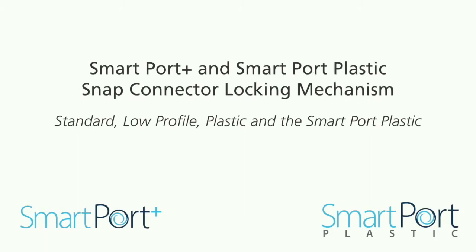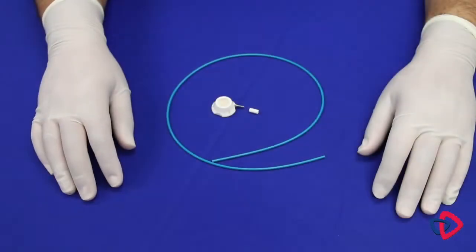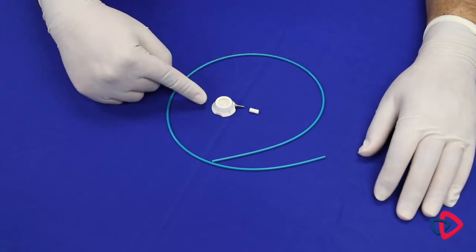In this section, we will cover how to securely connect the port stem and catheter of the SmartPort Plus standard, low profile, plastic, and the SmartPort plastic using the snap connector locking mechanism. You will find the catheter, the snap connector locking mechanism, and the port body are located within the procedural tray.